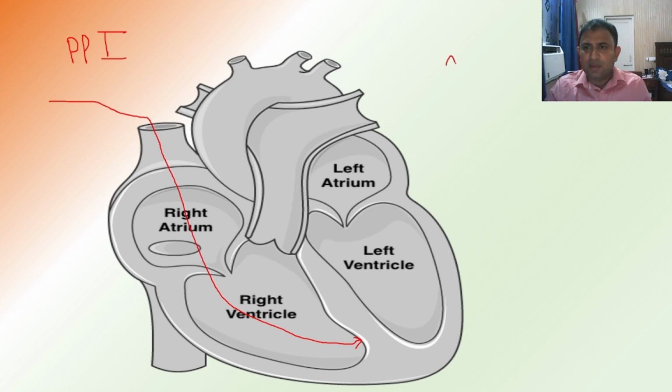Whereas in the single lead case, there will be P waves distributed throughout, and then there can be a pacing spike over here, and then a ventricular spike. Then there can be a ventricular spike over here, then here, irrespective of wherever the P wave lies. It will forget about the P wave.